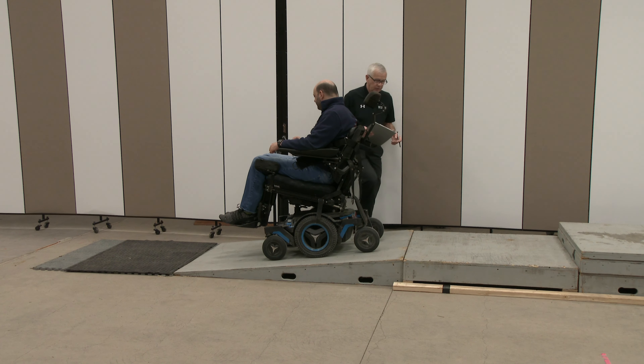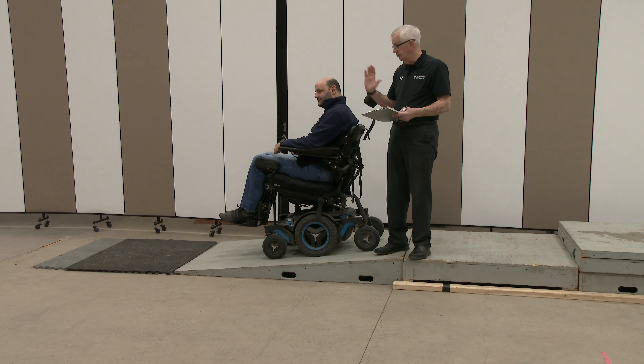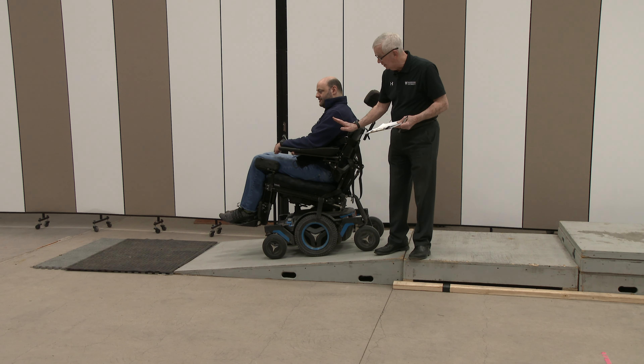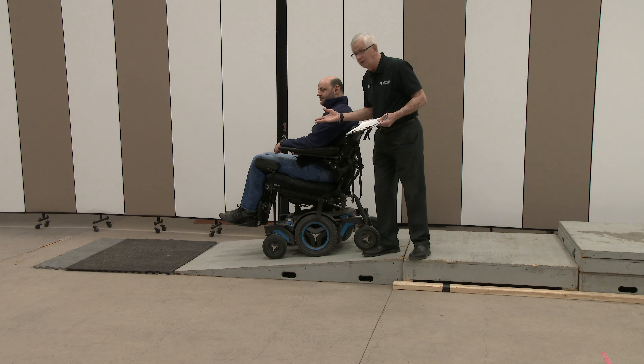You'll notice that before they started, they tilted the chair back to keep the weight on the rear wheels so they don't lose traction for braking, and the rear wheels aren't needed as much for propulsion. They may be needed to keep the chair from running away. Also, by tilting the chair slightly back, it keeps the person more upright so they're not going to tend to fall forward out of the chair when they reach the transition at the bottom.